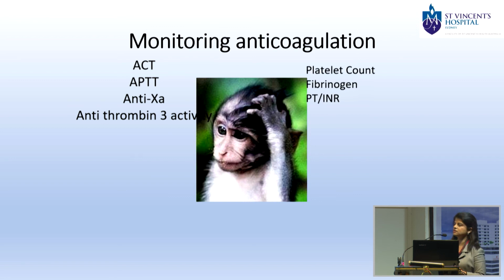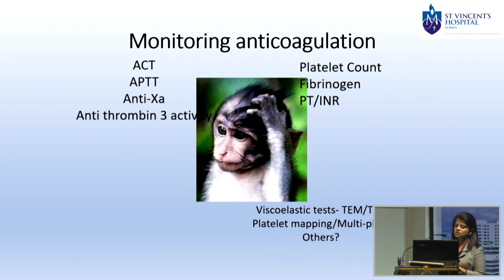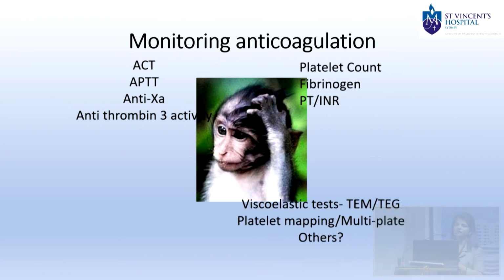These are sort of the standard tests for coagulation, which we would do every day. We have a bit of an interest in these viscoelastic tests in ECMO patients, but we use them in ECMO patients who are bleeding. So we use ROTEM, and we have an algorithm which is goal-directed, which tells us what products to give, because you want to stop the bleeding, but at the same time, you don't want the circuit to clot.